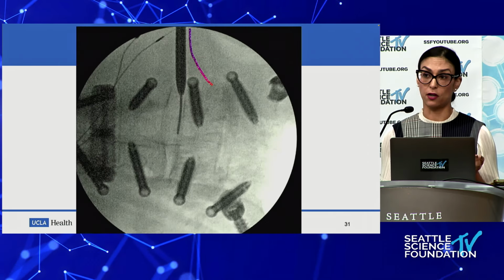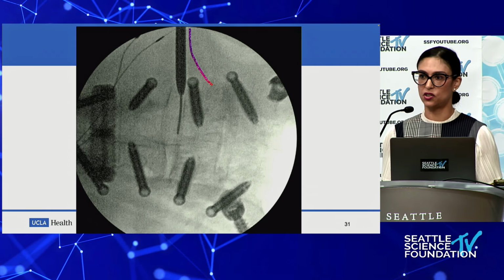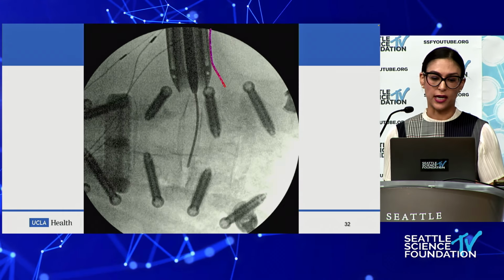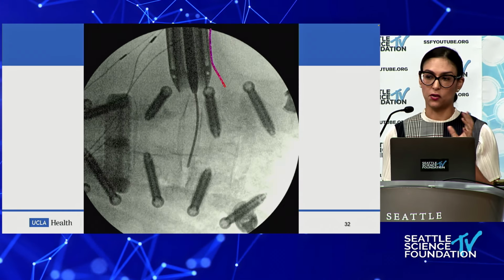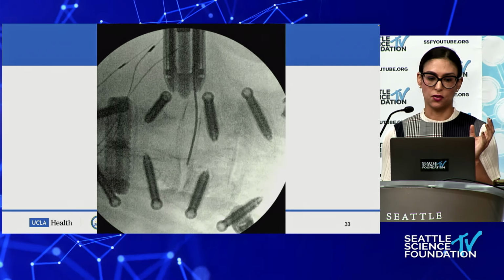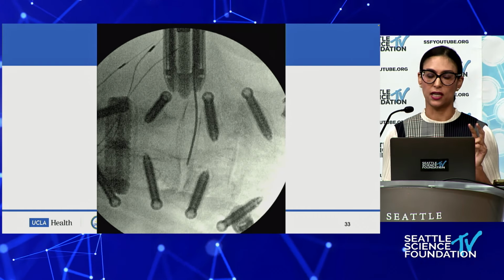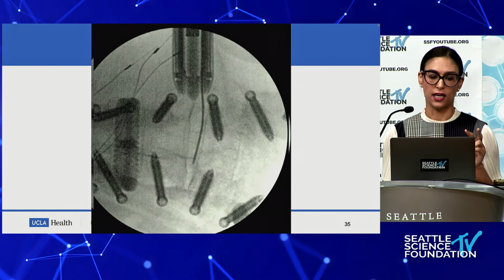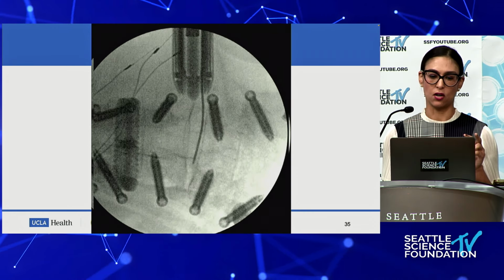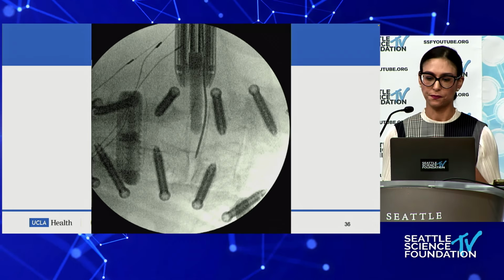The same issue comes up at L4-5, where, let's say you can even get that dilator into the disc space, which is a nice way to anchor it like we talked about earlier. But once you've got your retractor in and you have to pull that dilator out, you don't necessarily have something keeping it from shifting away. So the solution that I found is taking those shims, and some of these dilators have two shims, and walking it in. If you can see that, you start up here, and then you angle and mallet, and eventually it will find its way into the disc space.